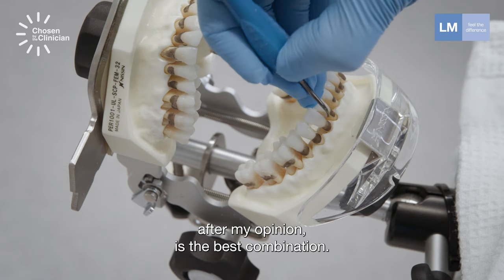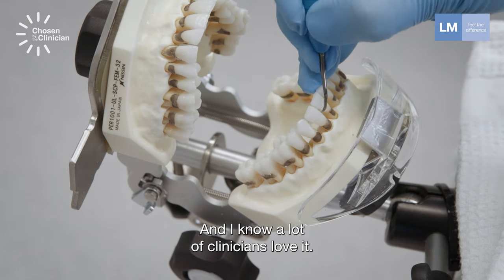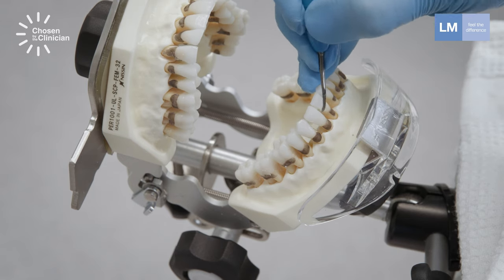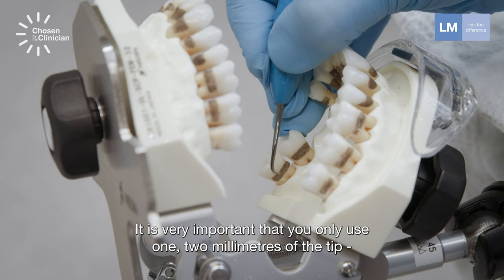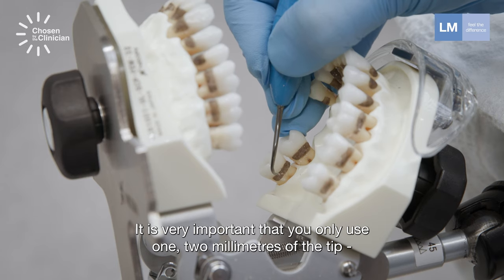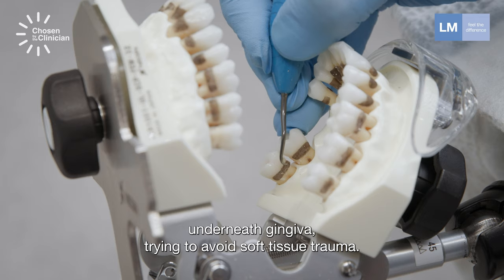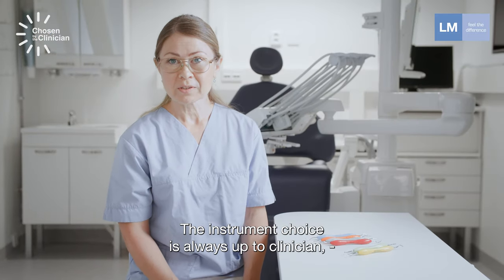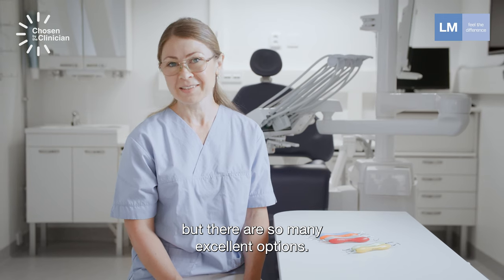A combination of curettes and sickles is, after my opinion, the best combination and I know a lot of clinicians love it. It is very important that you only use one to two millimeters of the tip underneath the gingiva, trying to avoid soft tissue trauma. The instrument choice is always up to the clinician, but there are so many excellent options.